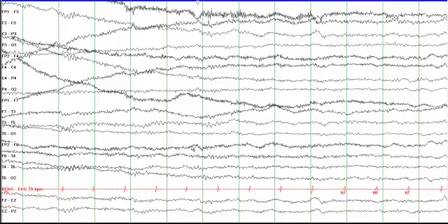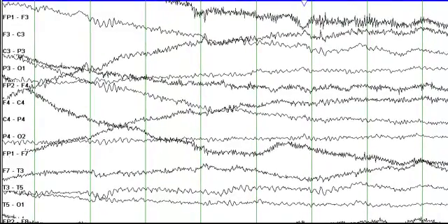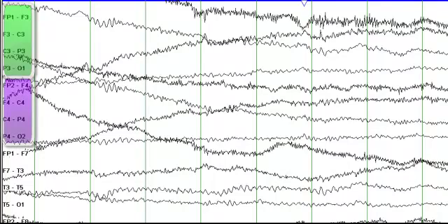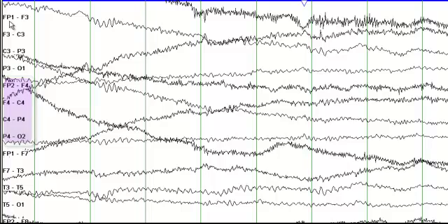Looking at the EEG, some very basics: all the odd numbers are recording from the left side of the brain, the even numbers are recording from the right side of the brain. The alphabets determine the location of the electrodes — Fp is frontopolar, C is central, P is parietal, and O is occipital.